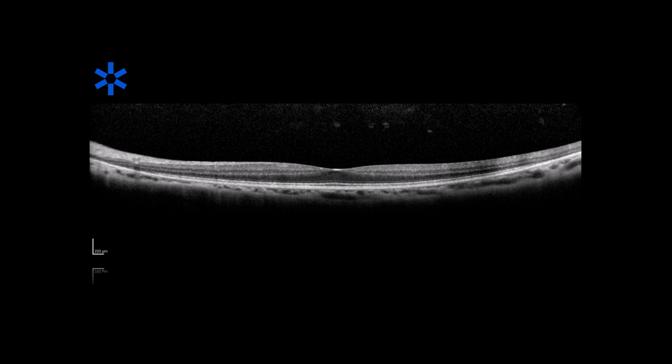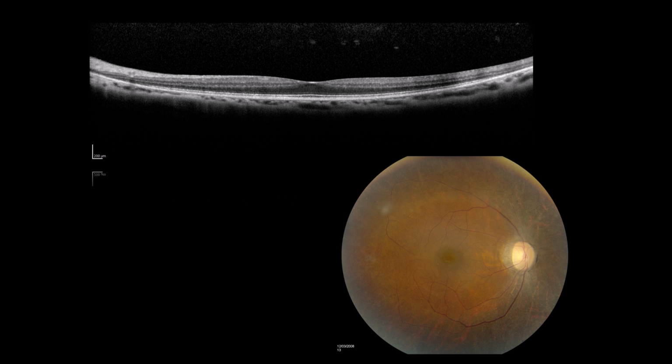And this is a patient with retinitis pigmentosa. You see the loss of the ellipsoid and the ELM as you get further and further away from the fovea. I call it pathognomonic. It's really not. Any pigmentary retinopathy could lead to this. So I guess, within that context, you could call it pathognomonic. This patient also has other stigmata of the disease. Something missing in the outer retina.